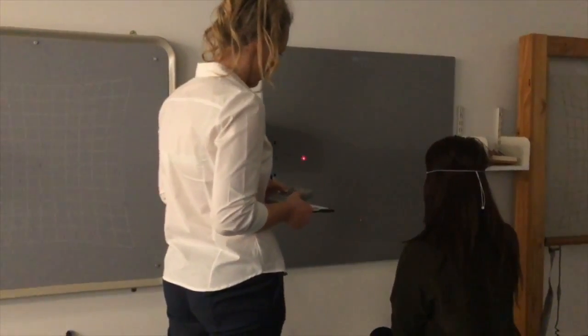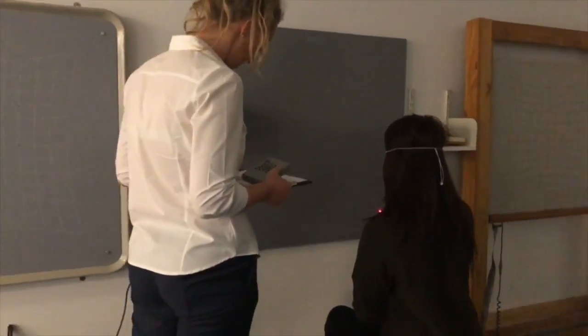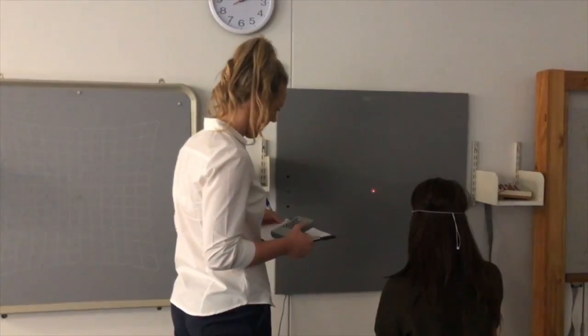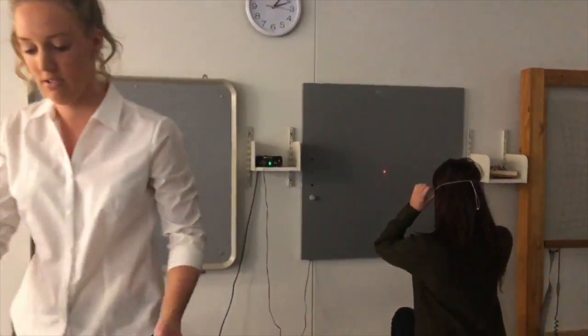Perfect. Wonderful. We are all done. I'll get you to pass me your torch and you can take your goggles off now.